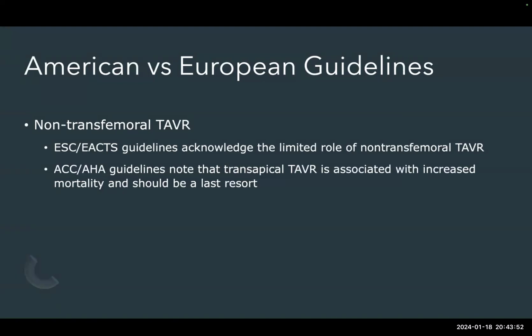The last thing for the guidelines between the American and European, the non-transfemoral TAVR. Whenever we say TAVI, we mean femoral. Whenever we are outside the femoral, those have a limited role, and the evidence is scarce, and we should say this should be a last resort.